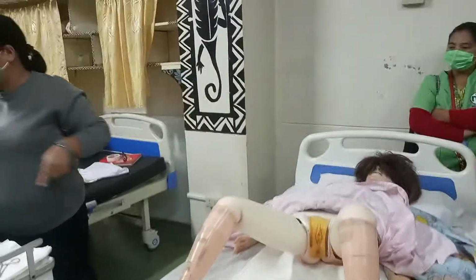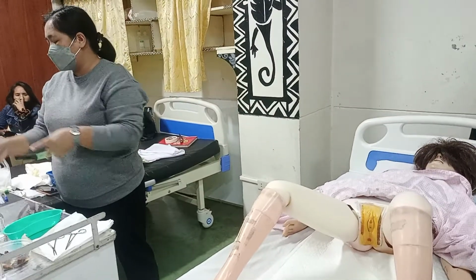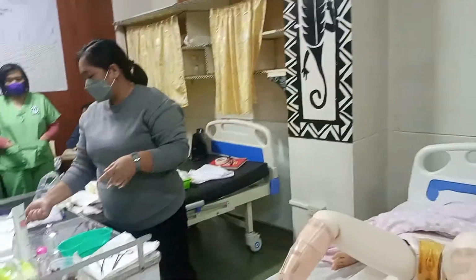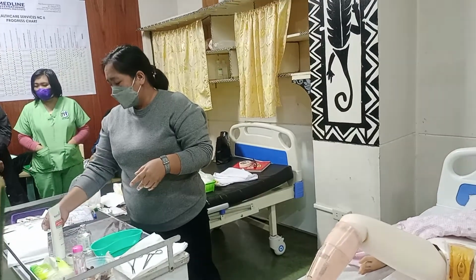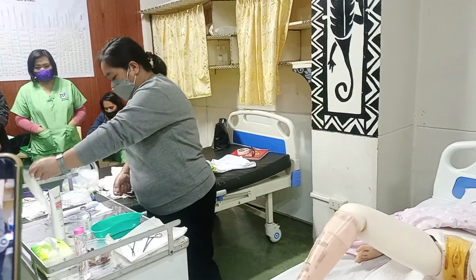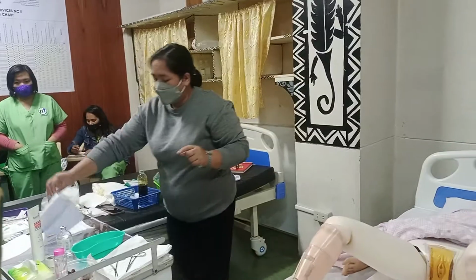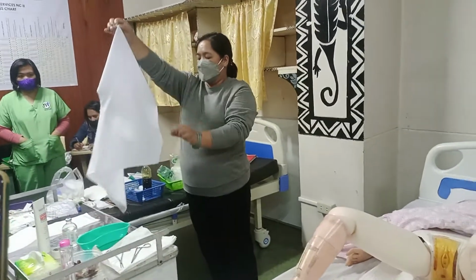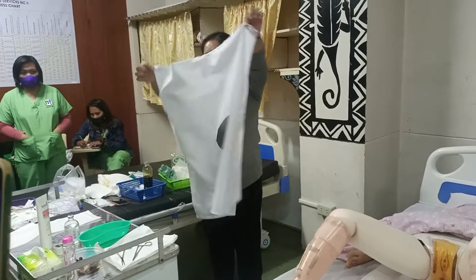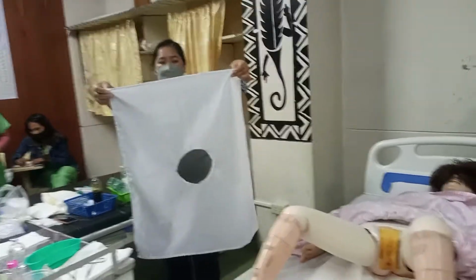Yung drape, kaya ko nilagay dyan kasi that's a sterile one. Okay, and sterile yan, hindi yan basta-bastang tinatouch. Okay, usually sa hospital, that's color white or color green. Naka-cover ng white cloth. So, open it. Yan. So, wrong side out siya. And then, itaas mo. Doon ka lang sa gilid, naghahawak. Sa gilid kasi hindi ka pa naka-sterile gloves. And this is sterile. Okay?